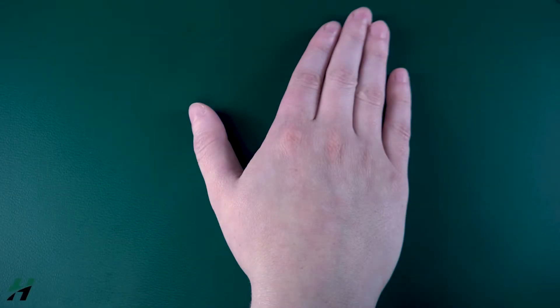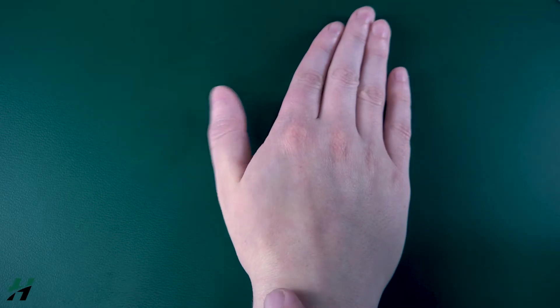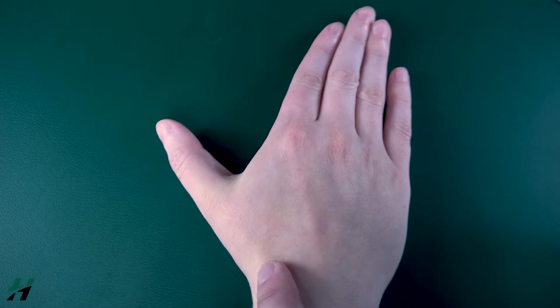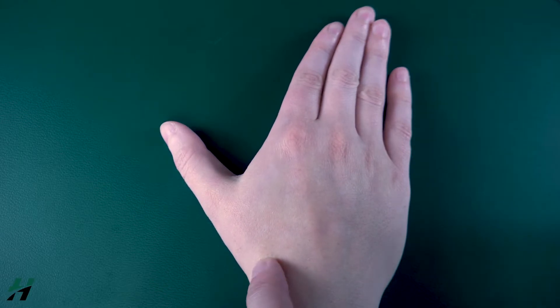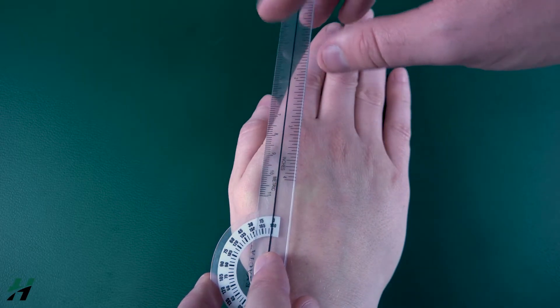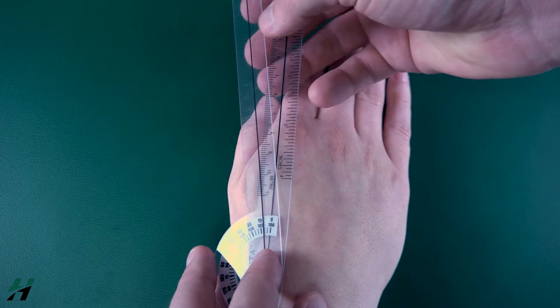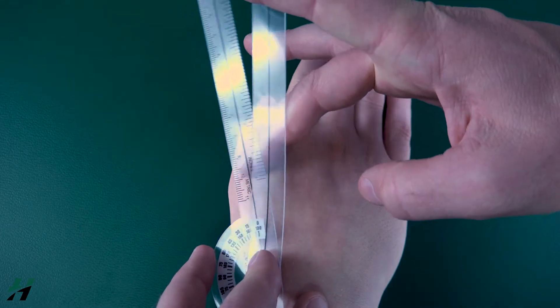Measuring thumb radial abduction, also known as CMC joint extension. The most important thing is to find the true CMC joint. Rachel, move your thumb back and forth — you can see this joint moving right inside the anatomical snuff box. We're going to put our axis right on that location, and then the stationary arm on the lateral aspect of the second metacarpal.